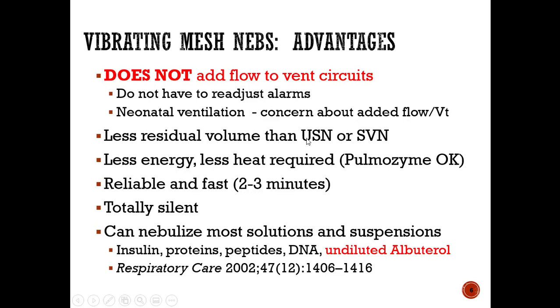I keep missing this little thing. I will do better with that, but I am not going to make you guys learn about the ultrasonic neb. So anytime you see USN or ultrasonic neb, just know that I just didn't delete it. I didn't catch it on that PowerPoint, and I am eliminating it from your data bank. But less residual volume is kind of the big takeaway. You're going to have more of that medication actually delivered to the patient, not left in the cup. Another huge advantage.